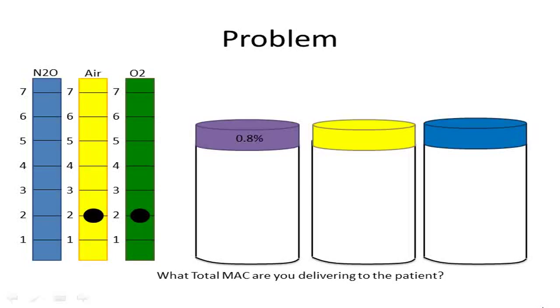The concept there in that case of releasing the O2, we can't leave just the O2, we have to dial down on our MAC because we have concentration of what we're giving, otherwise we're going to increase the MAC. No, you're not. Because remember, this is only adding. Whatever this total flow is, it comes over here and picks up 0.8%. So regardless, that's all you're getting in the mix is 0.8%, at least in that example.